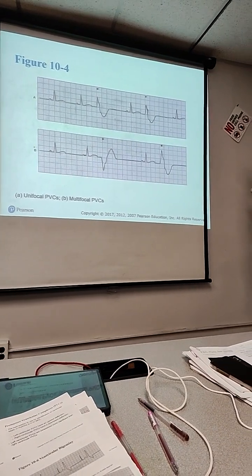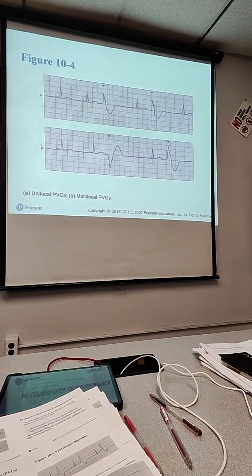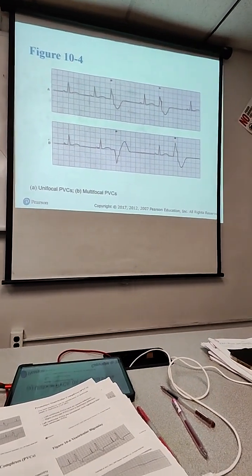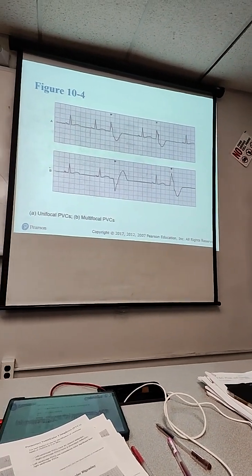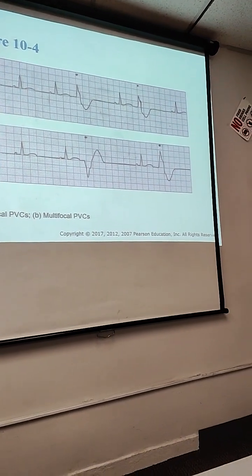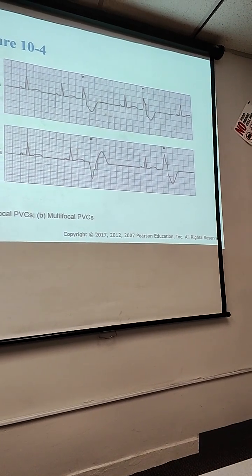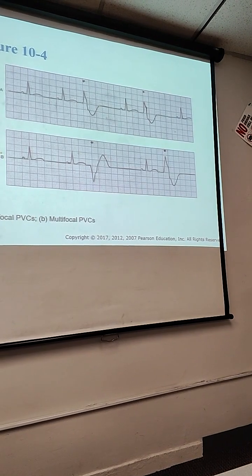Okay, let me help you out. Now you're going to say, oh yeah. Remember one of the first chapters that I told you? The ST is negative on A. What was that? The ST, isn't it negative? Okay, stand up and show it to me.